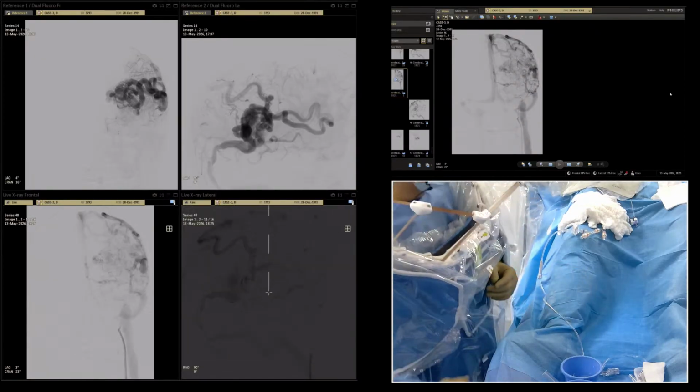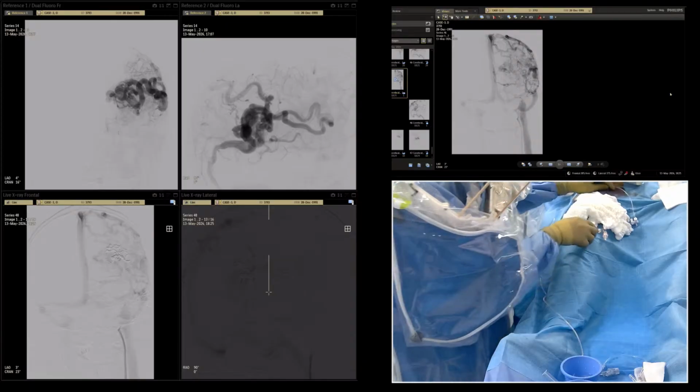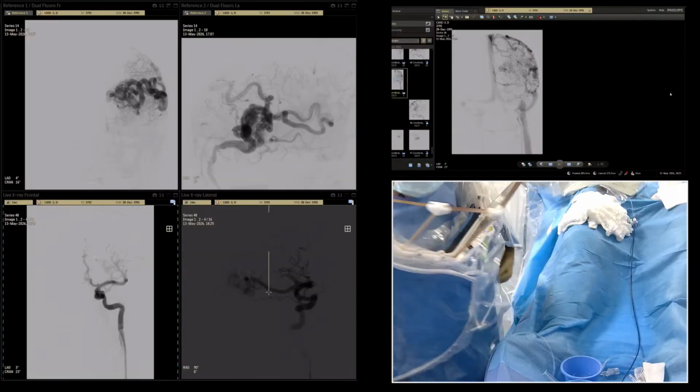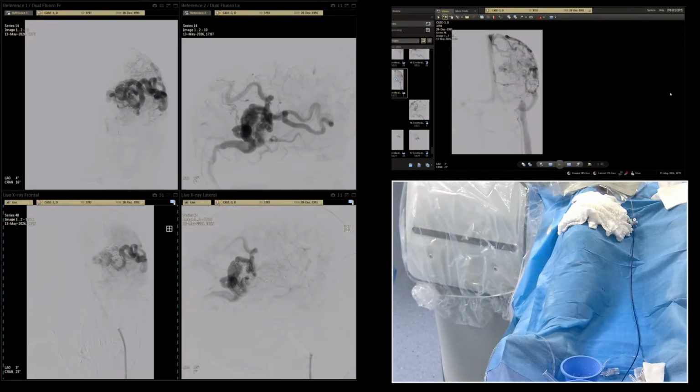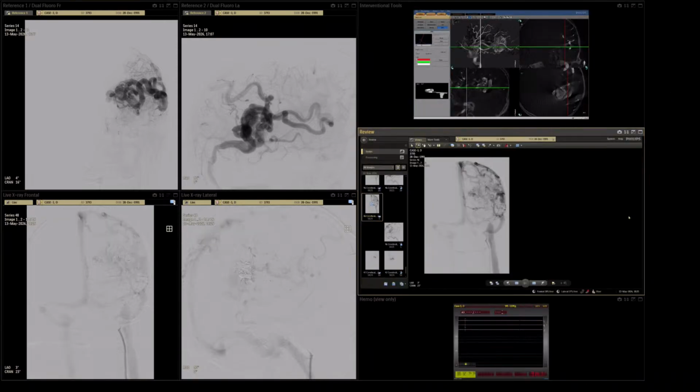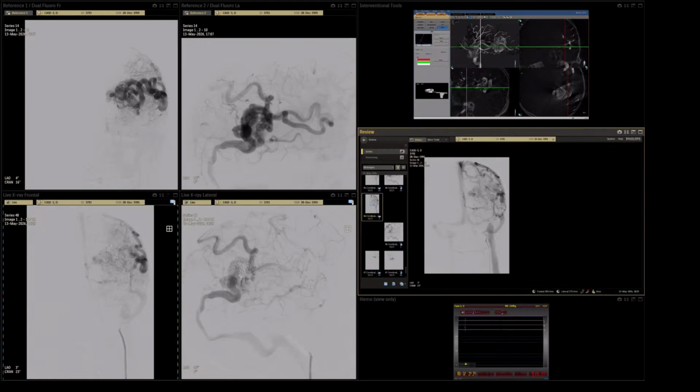It's a staged embolization, that's why we'll finish at this point, and now Devlet will do control angiography. The next session we can do in a couple of months, huh? Yes, I hope so. Choroidal, I think it would be next session. Okay, let's see the control.